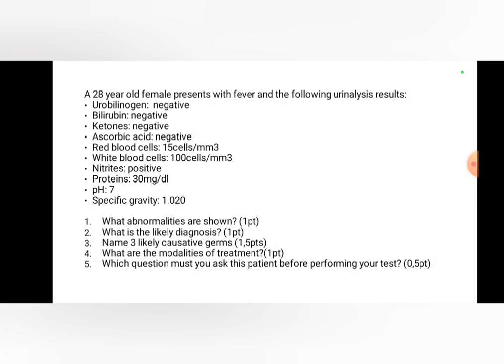Now you have blood divided into two portions. You have the part that speaks about hemoglobin, and there is a part that speaks about just hematuria. If you go on urine dipstick, you see a certain portion that speaks about hemolyzed blood and non-hemolyzed blood. Is it clear? When you have hemolyzed blood, it is much more hemoglobin that they are speaking about.